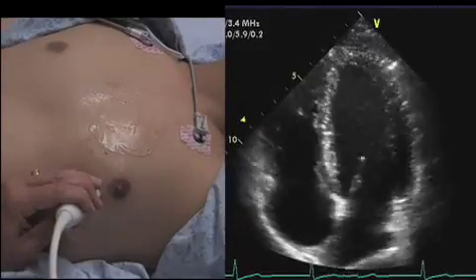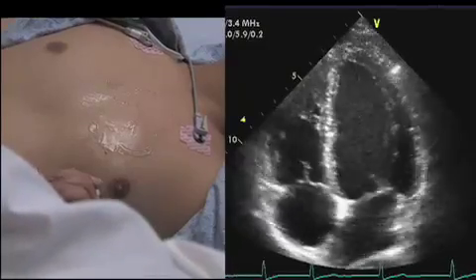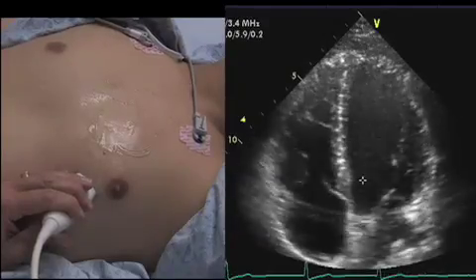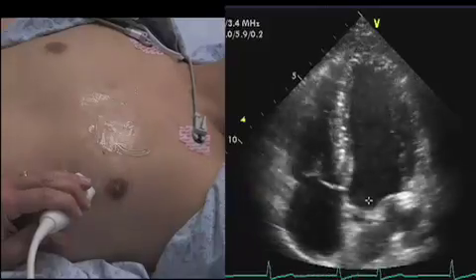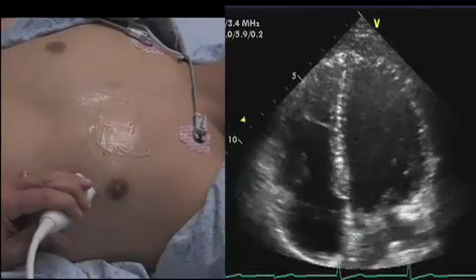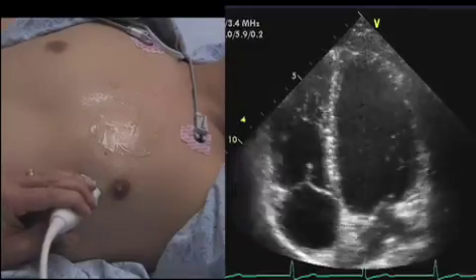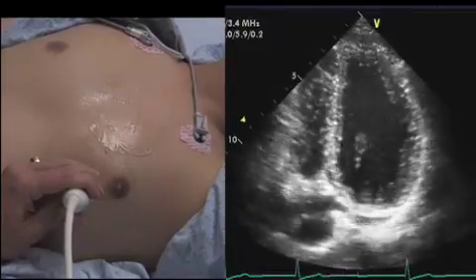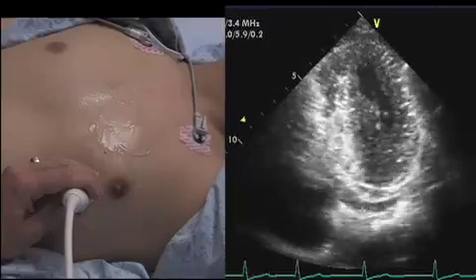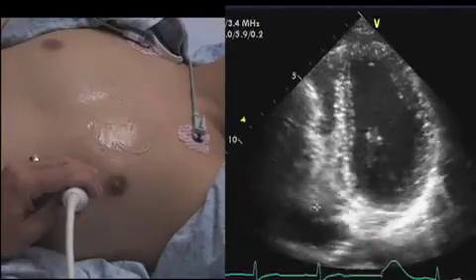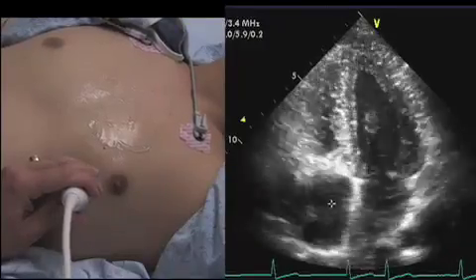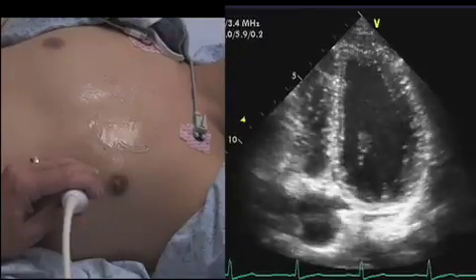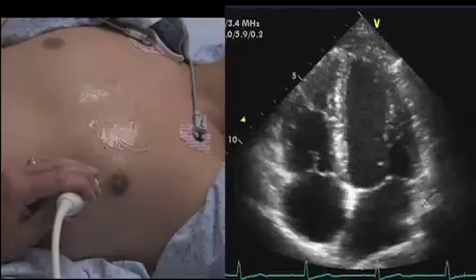Now I'm in a nice apical 4-chamber view. How do I know it's a good one? If I'm bringing in the aorta in the left ventricular outflow tract, that means I have too anterior of a 4-chamber view. Conversely, if I'm starting to see a vessel back here — that's the coronary sinus, which comes around in the AV groove and drops into the right atrium — or I'm seeing an opening on the interatrial septum, I'm too posterior. I need to angle more anterior to bring in the true 4-chamber view.